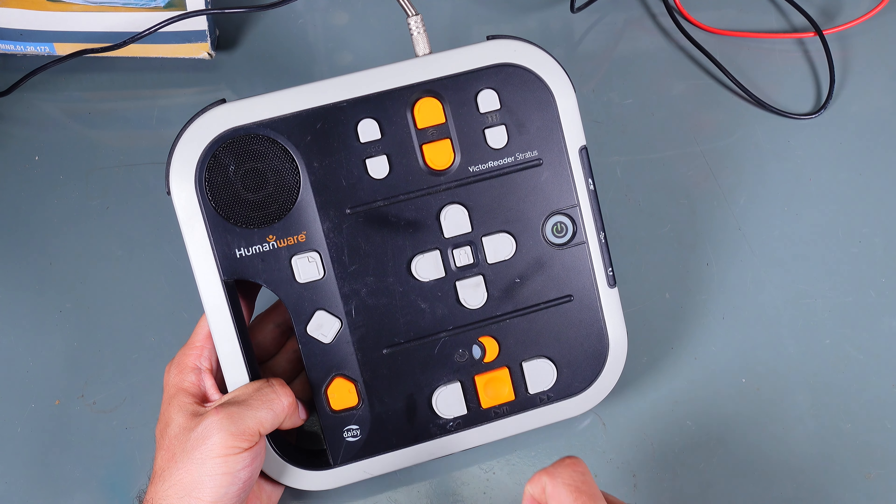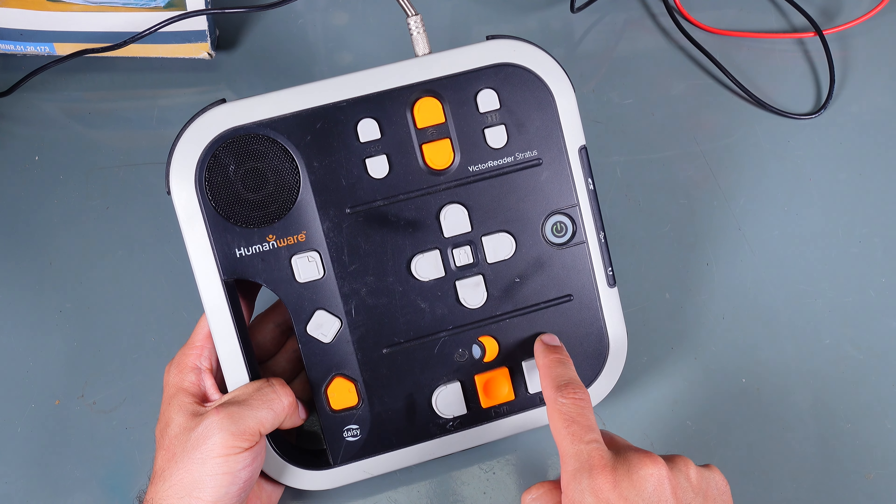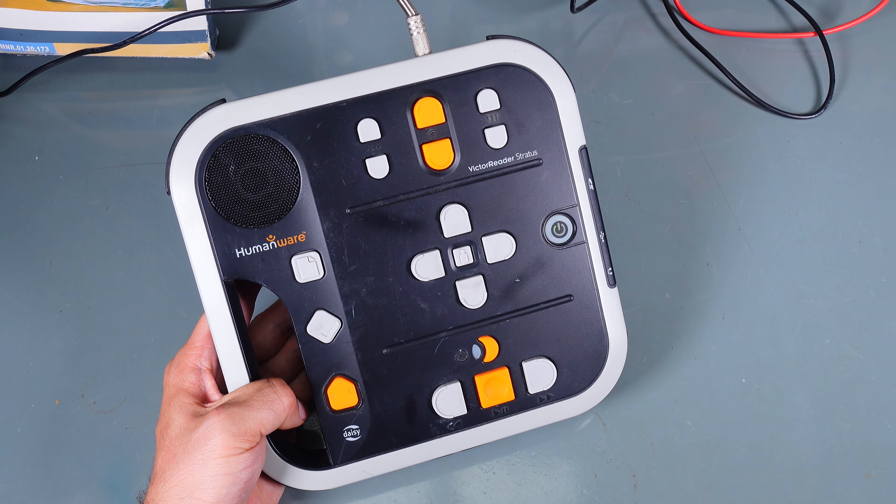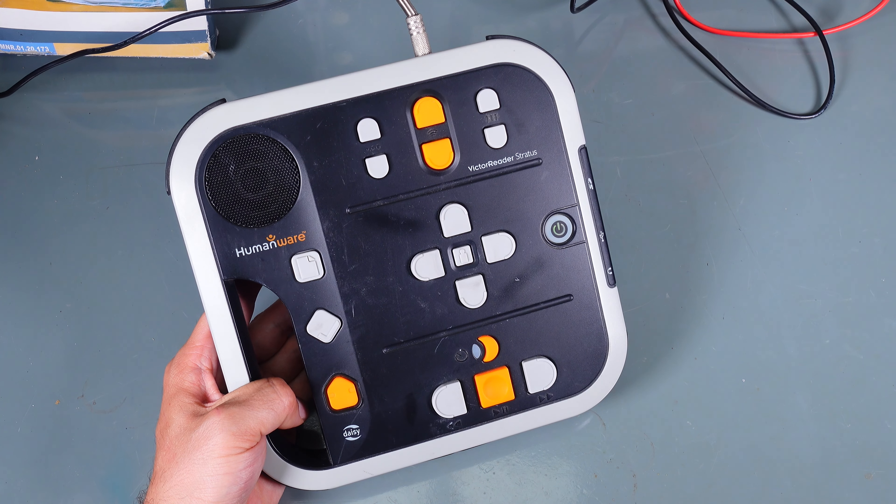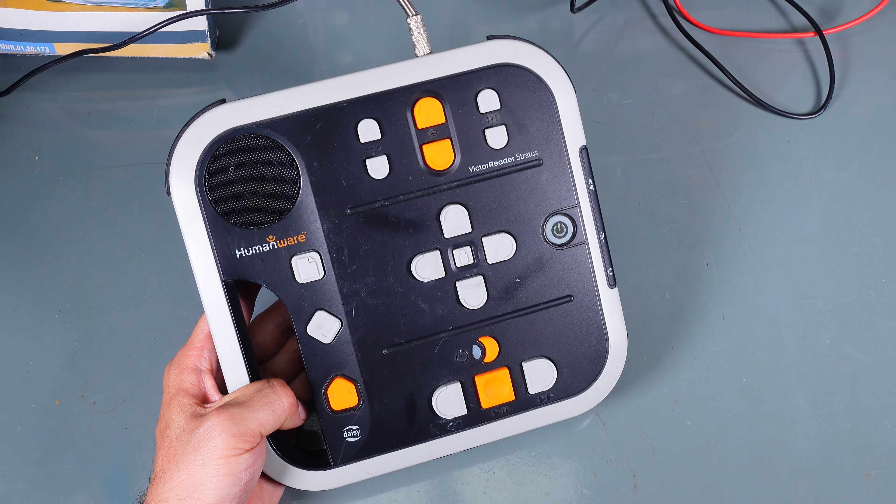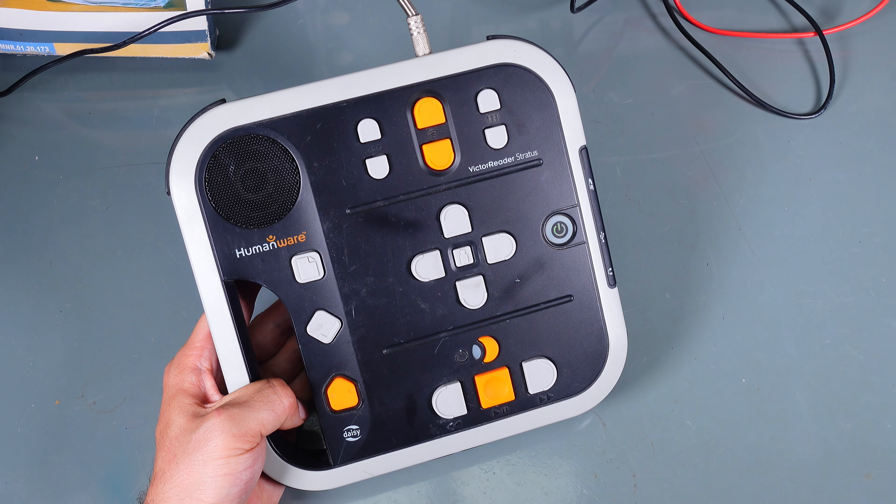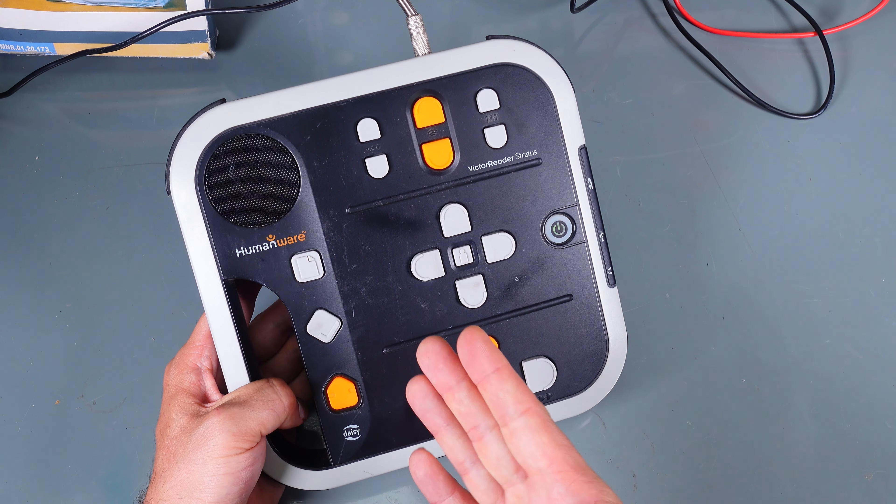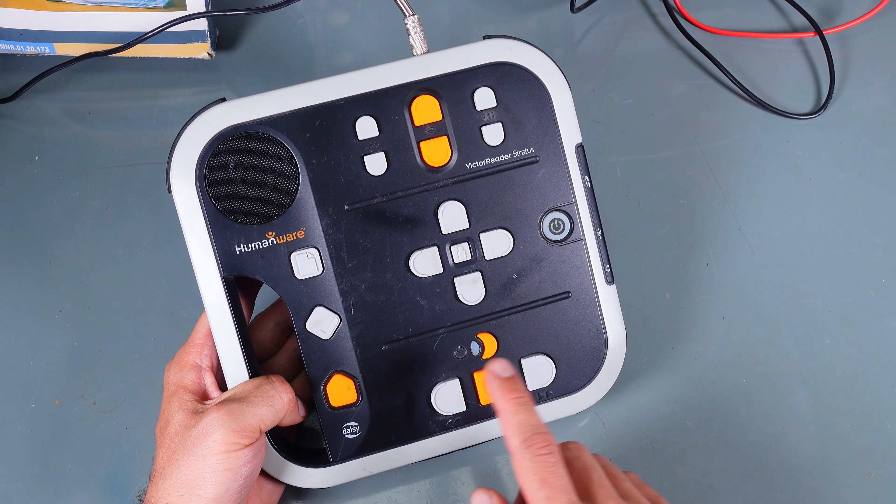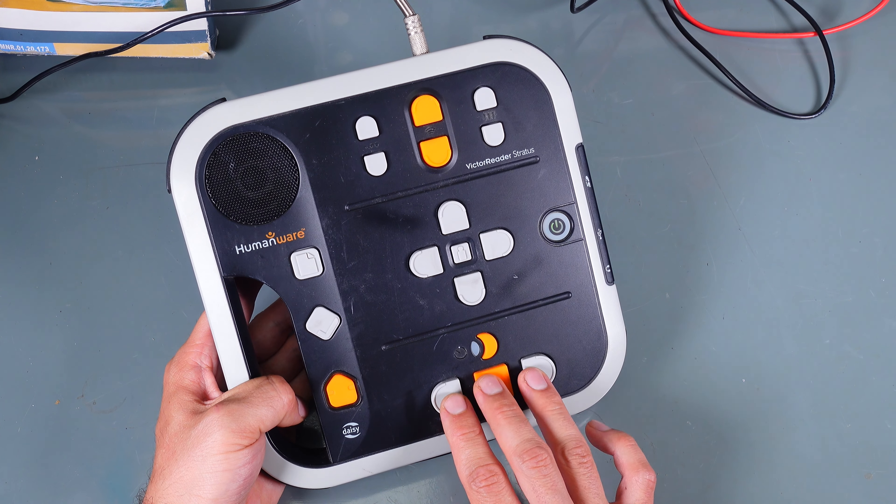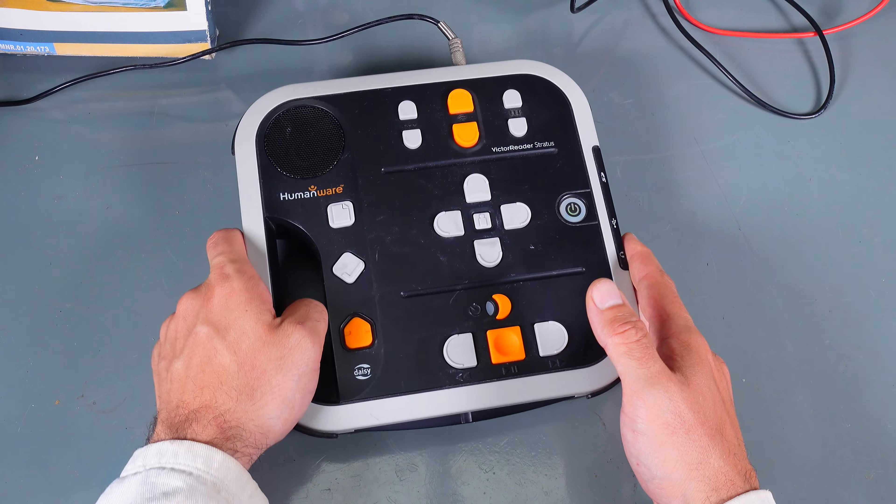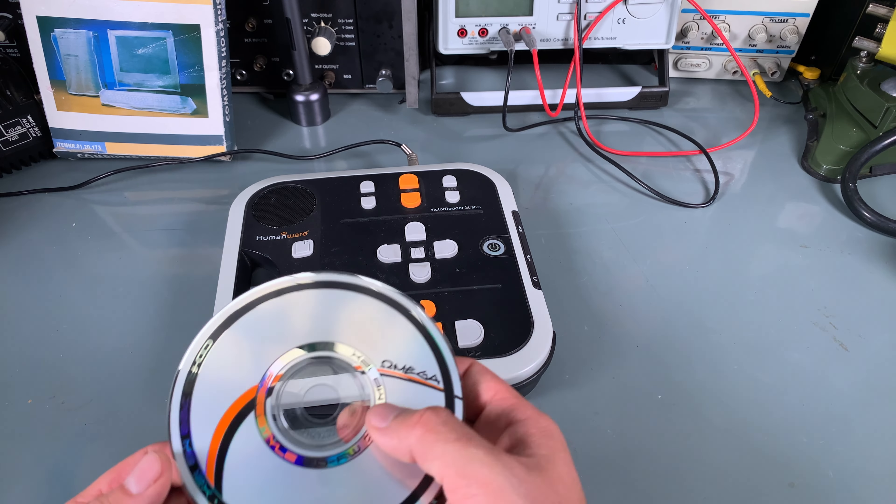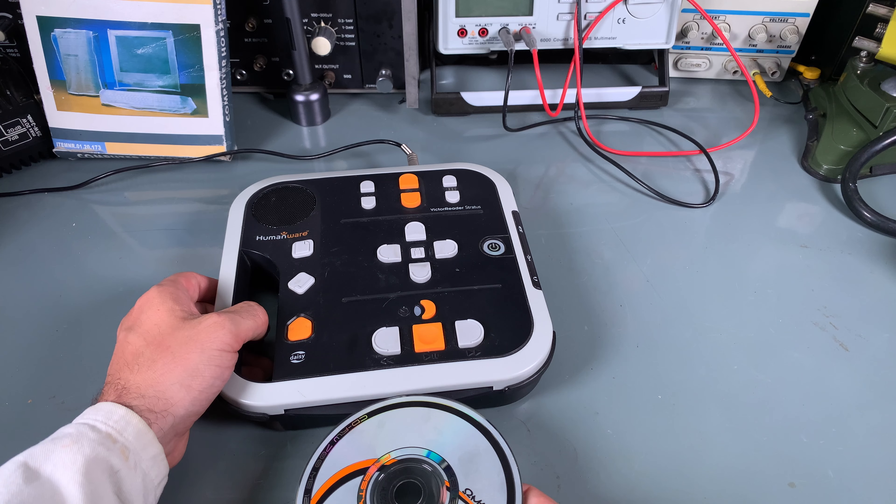Here is a button for telling time. If I press it, as you can hear, it reads the date. We've got buttons for controlling the player, and this is what I'm going to try. I've got a CD with music.